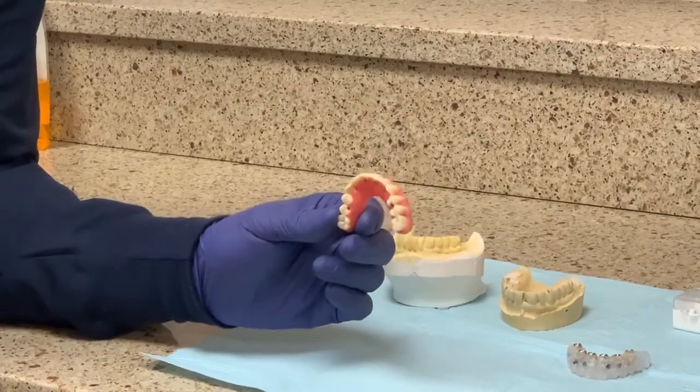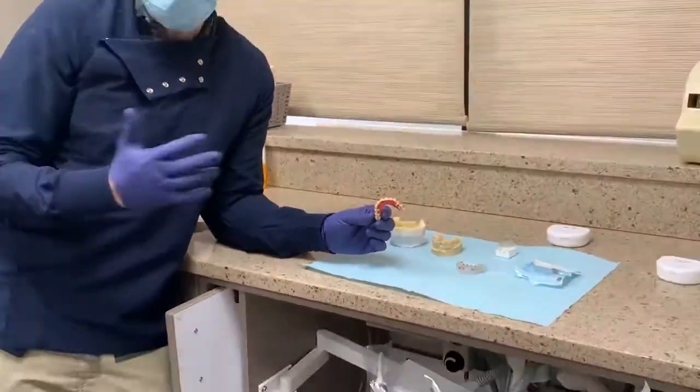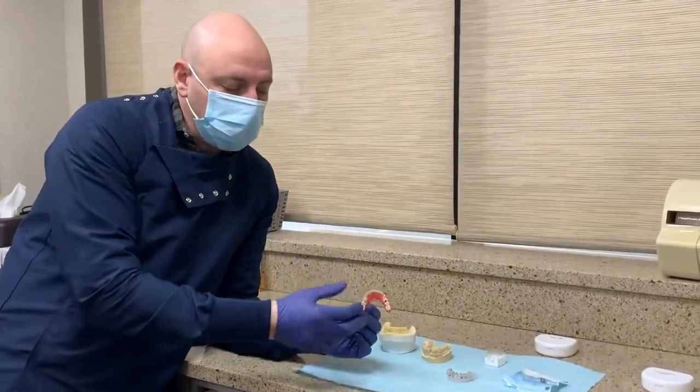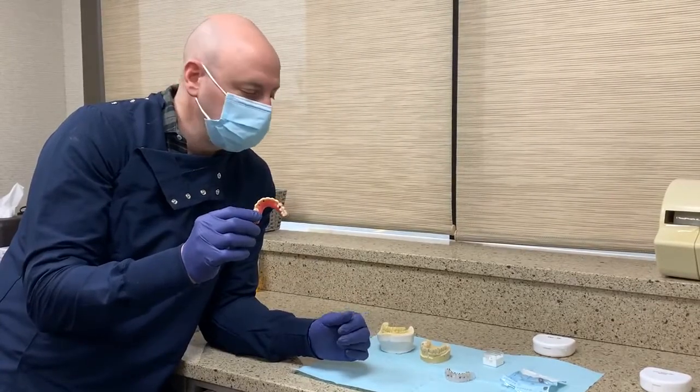So we're just going to try it in. We're going to confirm our occlusion. We're going to confirm the aesthetics and tooth position. And if everything looks good, then the laboratory is essentially just going to make a duplicate of this in the definitive material. So that's it.